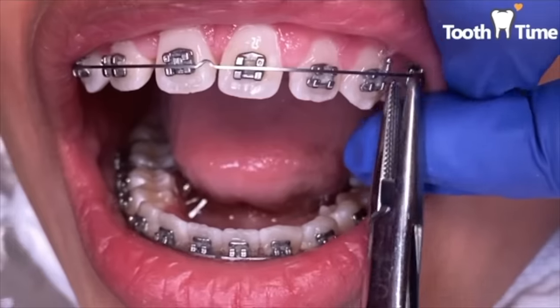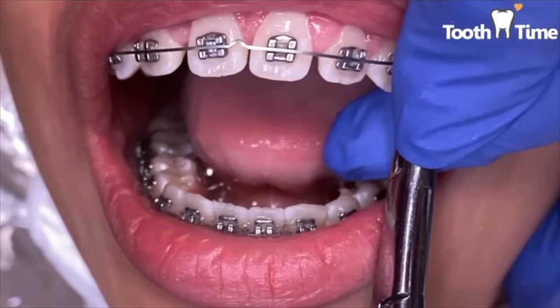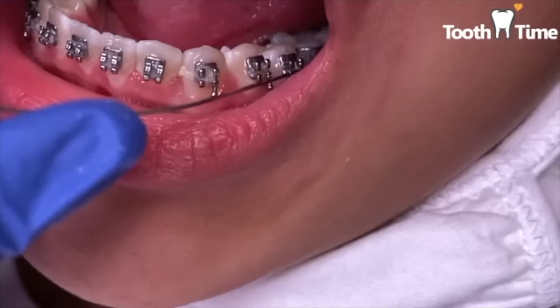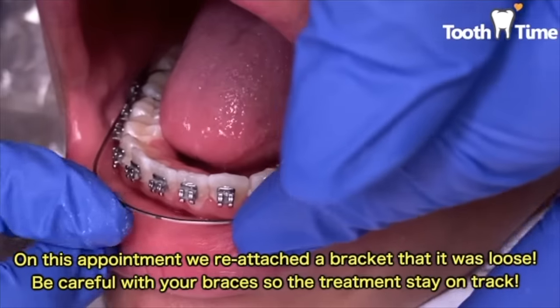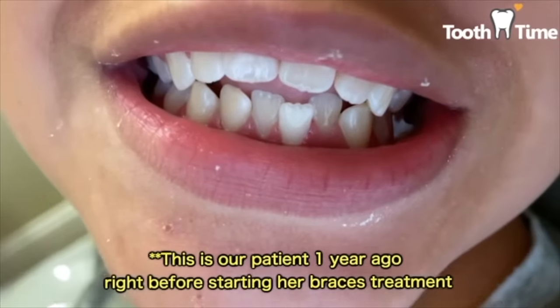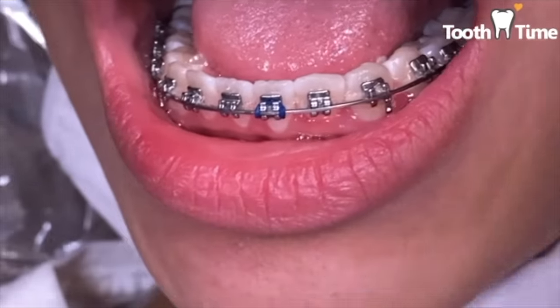Much, much later. That's what we call an 18 by 25 wire, which you'll be able to know which wire it is. On the top, you'll see what we call a little mountain in between the two front teeth, what people always call buck teeth, but it's the two front teeth. You'll have a little mountain shape on the wire, and that's the wire that we put on. When we use that wire on top, it can sometimes create space, which is diastemas in the front two teeth. So we'll put a power chain from the two laterals on the top right to the top left to help maintain any closures and prevent any space.